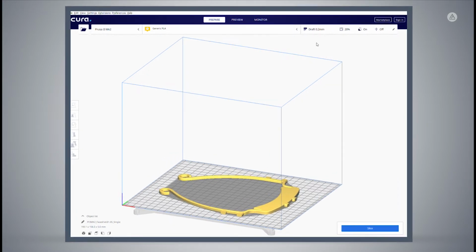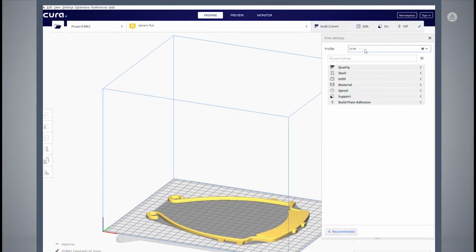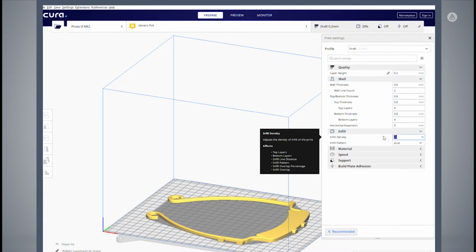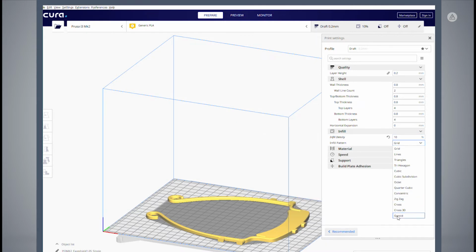Now let's look at our settings. Click on the settings bar at the top right and select custom. We want speed and reliability, so we're going to select the draft preset from the profile dropdown at the top. Under quality, our layer height will be 0.2 millimeters, which will print quickly but reasonably smoothly. Under shell, I will leave my settings at default with a 0.8 millimeter thickness for my walls, floor, and ceiling. For infill, 10% density is strong enough while still printing quickly. Gyroid pattern works well, but grid and triangles will do just fine if that's what is available in your slicer.